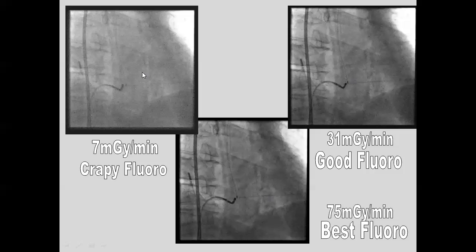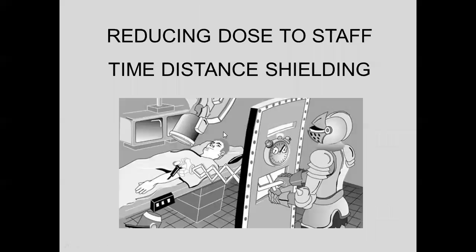And what I find really cool now is I've worked enough with the doctors that us as techs know when we need to change the fluoro for them. So they don't even ask anymore. They just expect it to happen. But if for some reason I forget to change it back, I'll actually have the doctors looking at the picture and saying, this is too much radiation. They can tell now visually, and they're asking for dose reductions. It's taken 10 years, but it's happening.